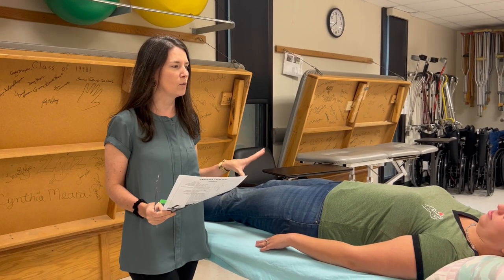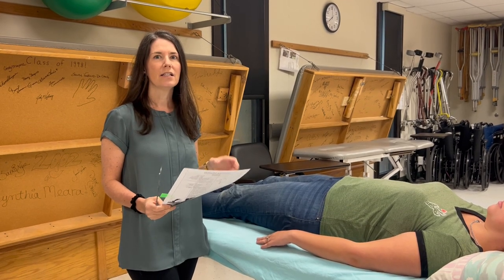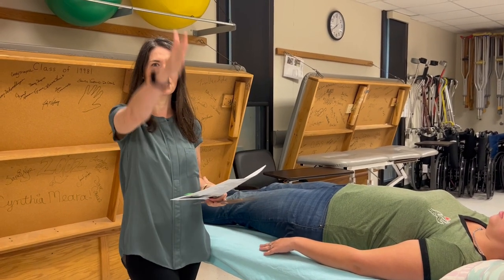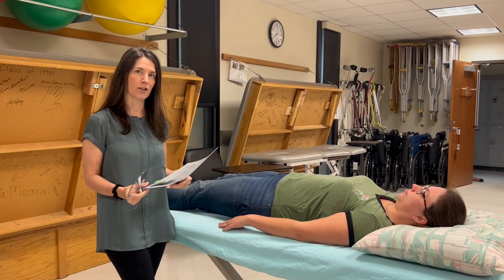We're going to start off in this video with shoulder flexion range of motion and then we will move on to MMT. Shoulder flexion happens in the sagittal plane, the end feel is firm, and the normal value is 0 to 180 degrees.